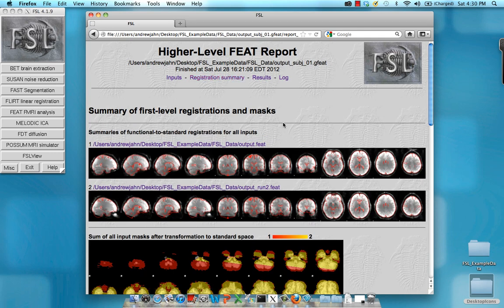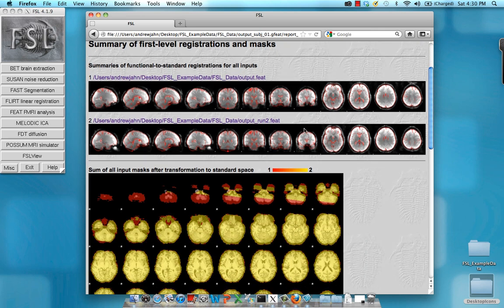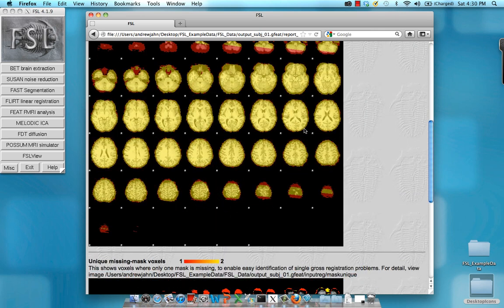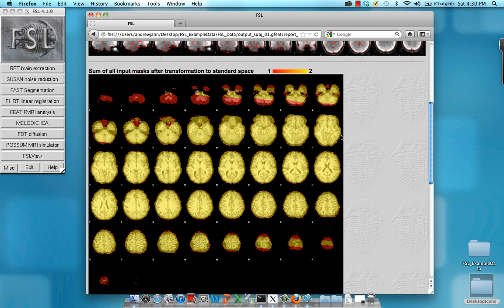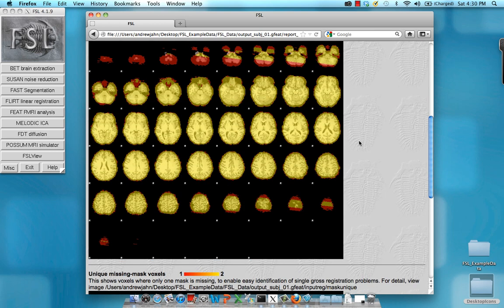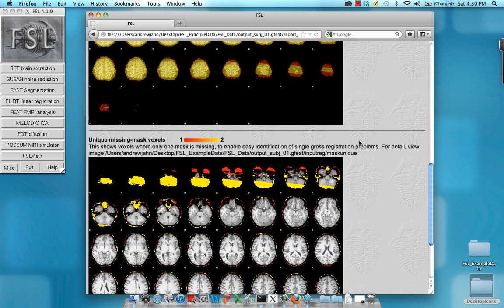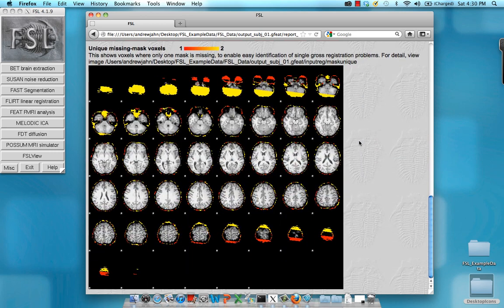Registration summary will show whether anything looks out of line. For example, if there was a large amount of red in this, there would be some cause for concern. It would be suggesting that the masks don't overlap very well. In this case though, it looks fine. And same with this.